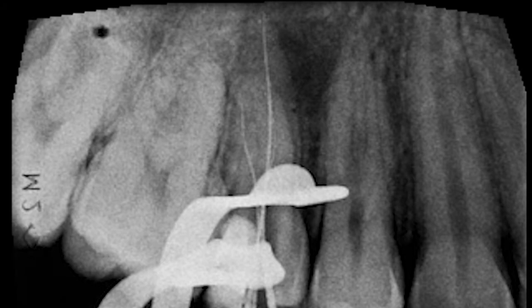Here you can see the palatal canal and the distobuccal canal, very good. A bit covered by the palatal canal, you can see the mesiobuccal canal. Also, you can see the massive inflammation on the mesial aspect of the palatal root, which is a sign that the filling itself was not the cause, but maybe a trigger for the complaints that the patient had.